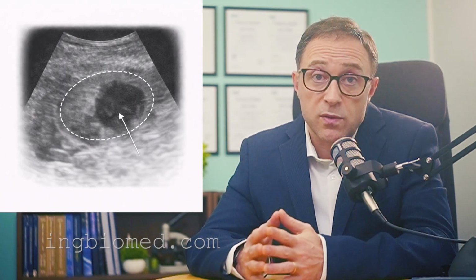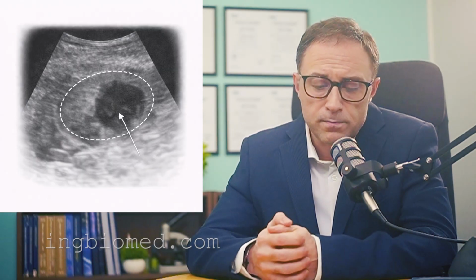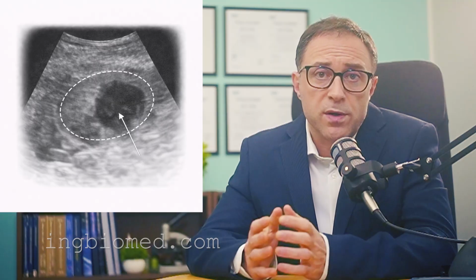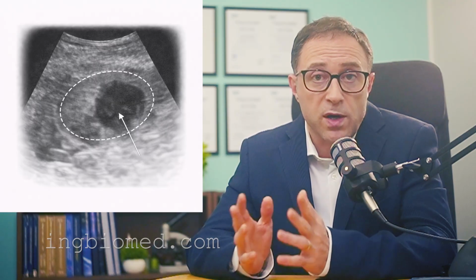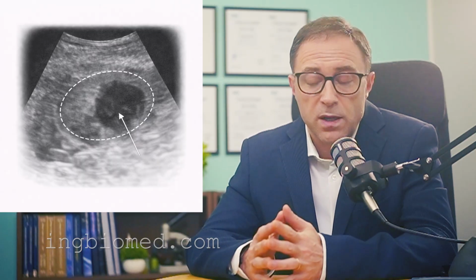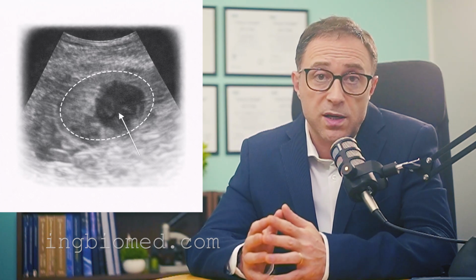And finally, we must consider renal and adrenal tumors. Small renal cell carcinomas may initially be isoechoic and subtle. As they enlarge, they become heterogeneous, distort the renal contour, and may invade the renal vein. Careful assessment of the renal vein and inferior vena cava is therefore mandatory in suspected malignancy.